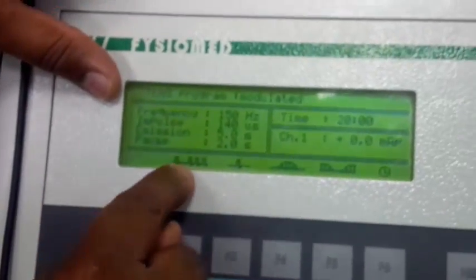Suppose he is having acute pain. Where is the code? If the patient has acute pain, how much frequency are you supposed to set? Between 80 to 120, so here the maximum is 120. How will you change it here? This is the frequency. F2. You can see the wave pattern here below. According to that we can modulate the button settings.